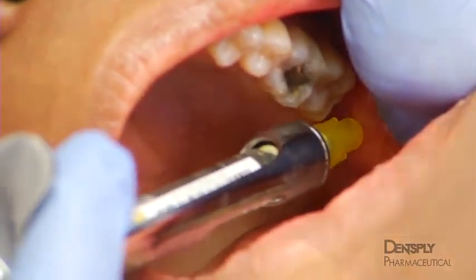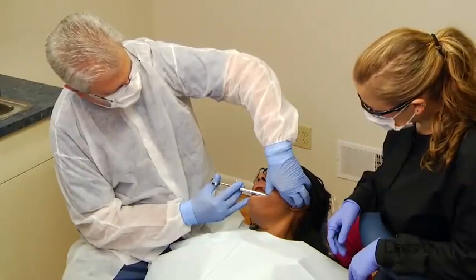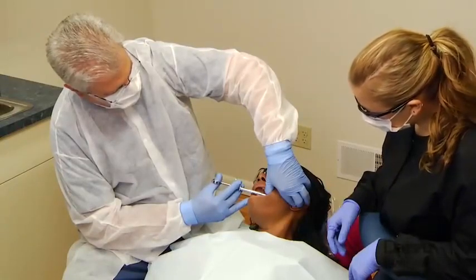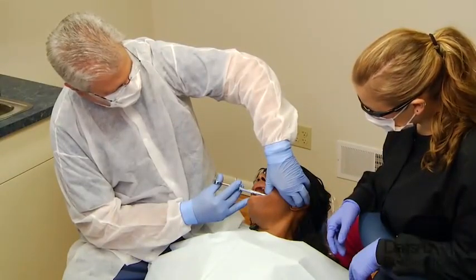When the needle impinges on the condylar neck, it is felt as a solid stop, in contrast to a glancing contact. Once the target is reached, the needle is backed off the condylar neck 1 or 2 millimeters, aspiration is performed, and the entire content of the cartridge is injected over a 1-minute period.